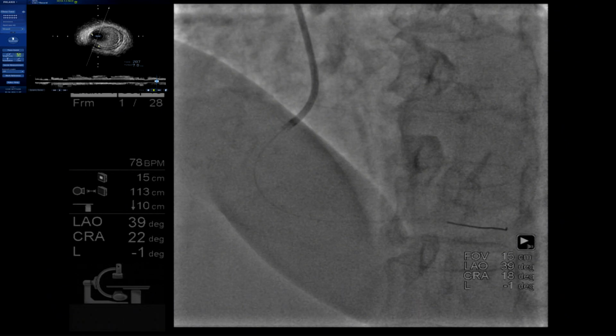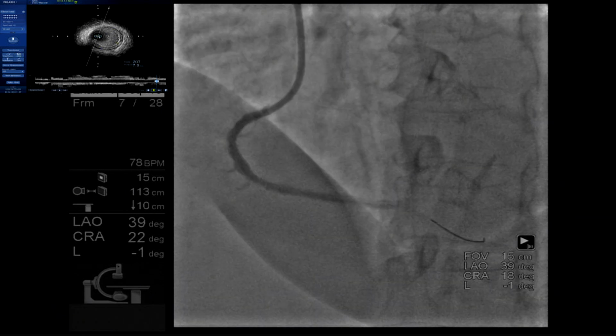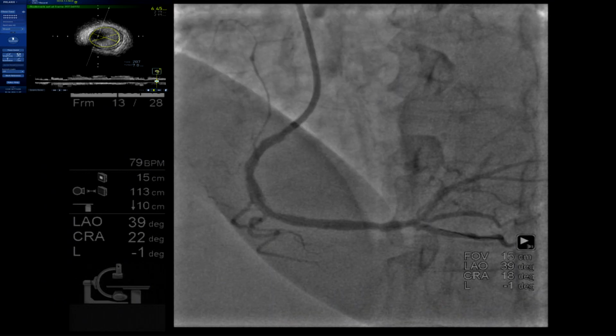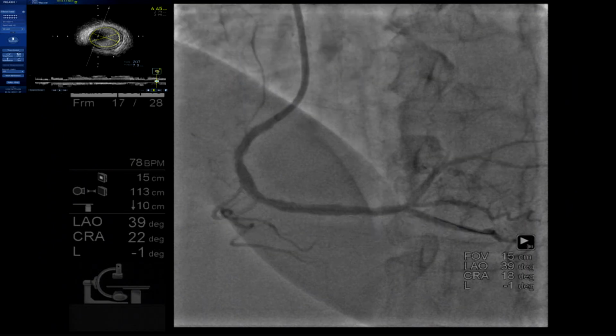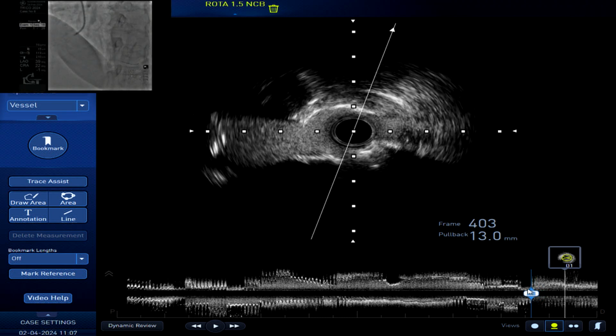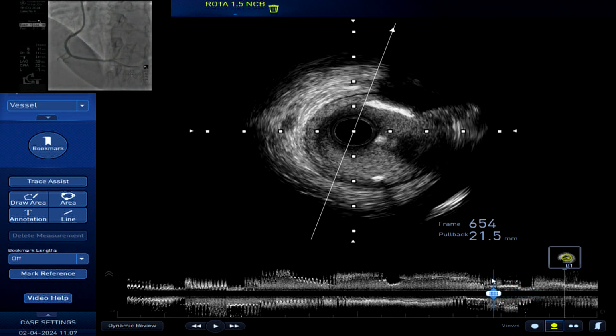Distal. For distal, again, can you tell me the distal artery diameter? 6.45. Yeah. So it is about 2.7? 2.75, yes. 2.75. Right. Here we can take maybe 3 millimeter. We have dilated. Yes. And we will dilate proximally slightly bigger. Yes. So 2.75. We have dilated proximal with 3.